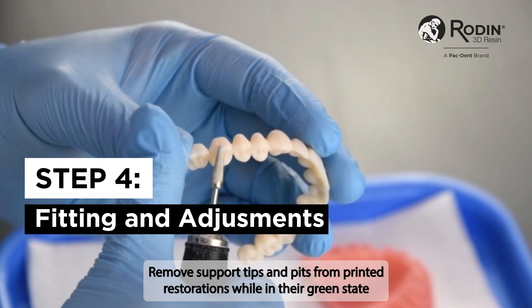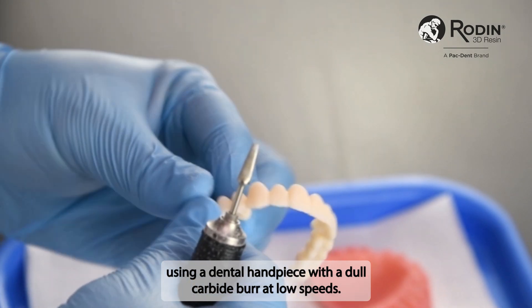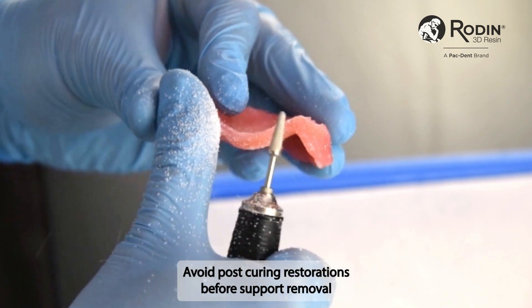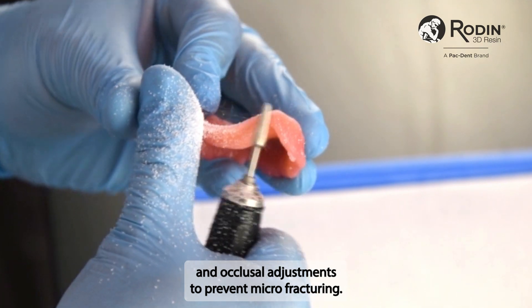Remove support tips and pits from printed restorations while in their green state using a dental handpiece with a dull carbide burr at low speeds. If needed, recontour teeth and make occlusal adjustments. Avoid post-curing restorations before support removal and occlusal adjustments to prevent micro-fracturing.